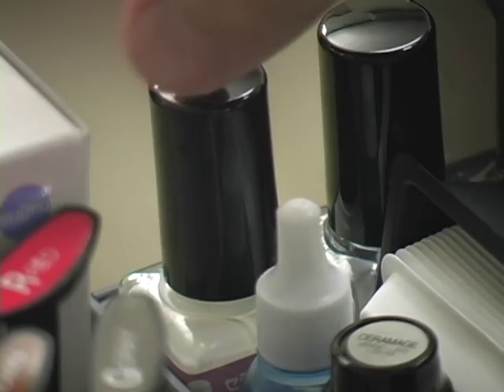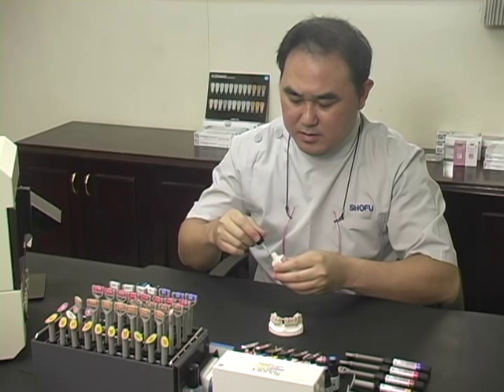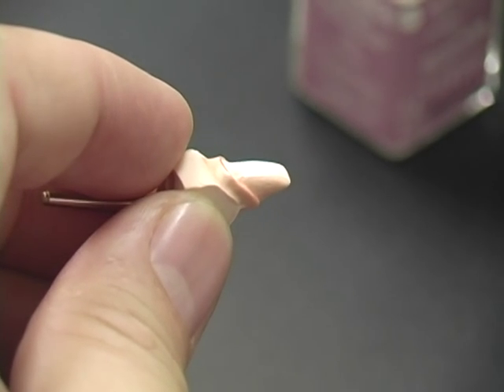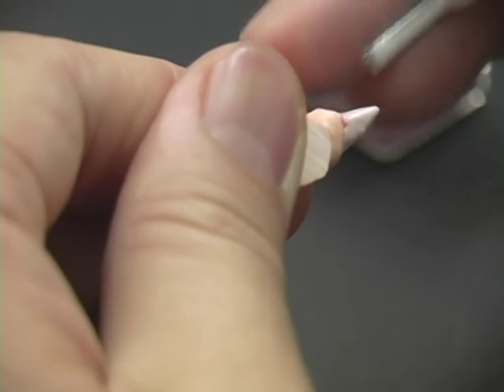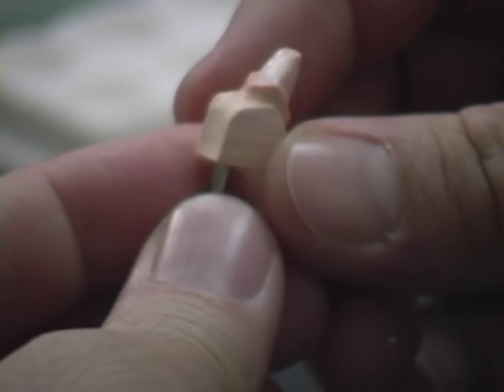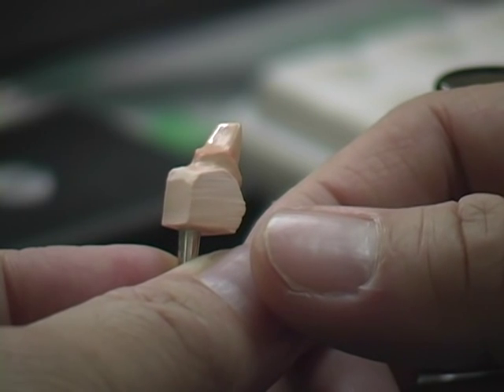Application of spacer. Shake the Ceramage spacer to ensure homogenous consistency. Apply a thin, even layer on the die and avoid application on the margin area. This step is important to achieve adequate space for the resin cement during final placement of the restoration. The Ceramage spacer is designed to change color from milky white to transparent when completely dry, indicating you can proceed to apply the separator.